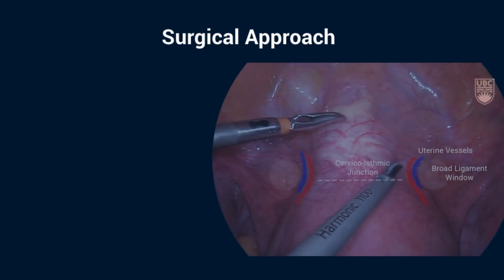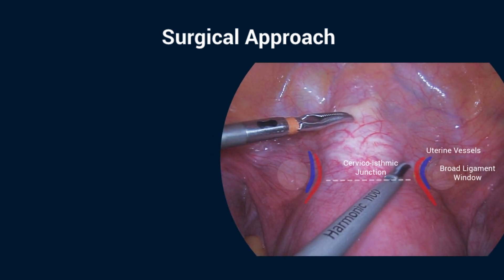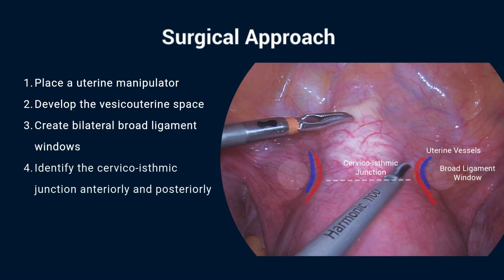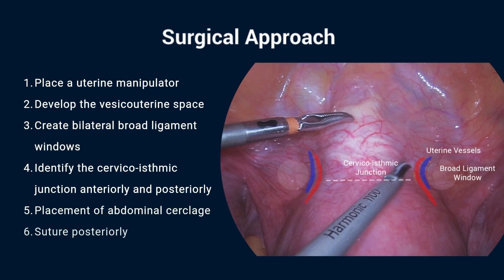Here we present a minimally invasive approach to abdominal cerclage. First, placement of a uterine manipulator when cerclage is placed pre-pregnancy. Next, the vesicouterine space is developed. Third, broad ligament windows are created bilaterally and uterine vessels are identified. The cervico-isthmic junction is then identified. The cerclage is placed medial to the uterine vessels and sutured posteriorly.